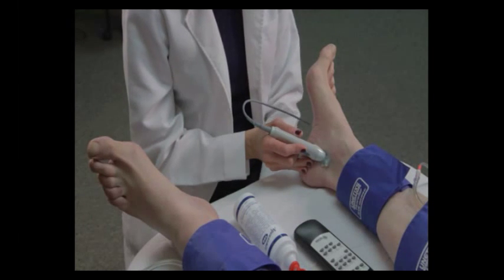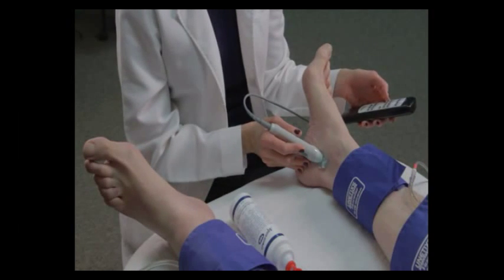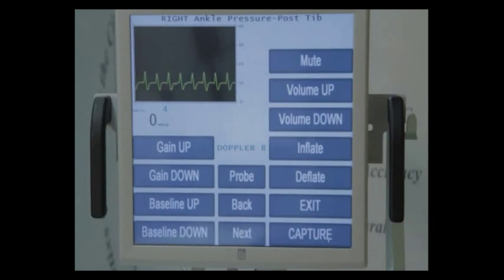We're going to add a little bit of volume now to help us find the vessel. We can hear the pulse. Now, once you hear the pulse, don't automatically start inflating. Make small, gentle motions on your Doppler probe, a little up, a little down, a little left, a little right. Looking at the multi-lab screen, we can see the waveforms coming across.